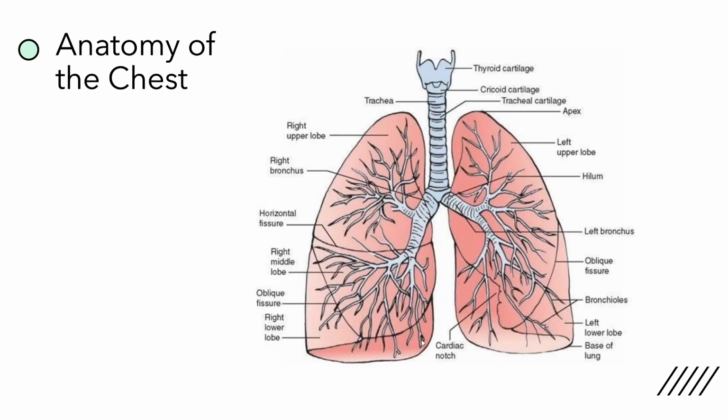The bases of the lungs, because of gravity, is where fluid likes to collect. So if we're considering something like a pleural effusion or somebody that has a pneumonia, we want to make sure we also capture the bases of the lungs, and that the person has an adequate inspiratory effort so we can see the nice bases of the lungs not obscured by the diaphragms.